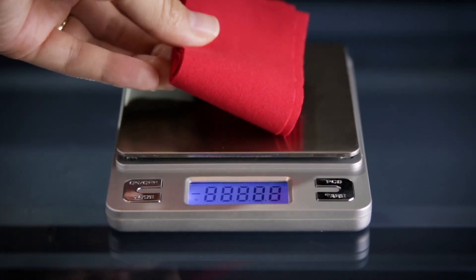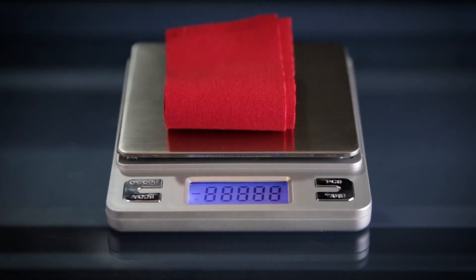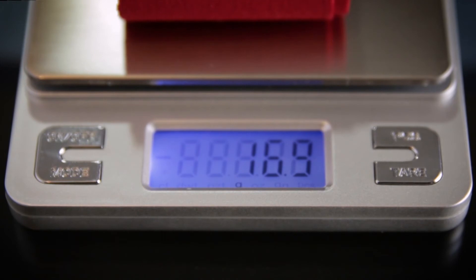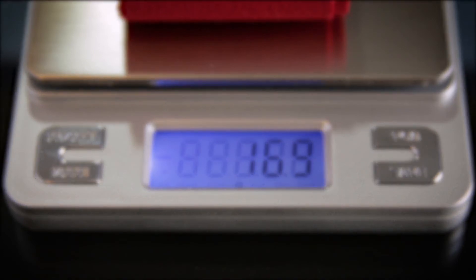Place all three fabric strips on the scale. Record the total weight, then calculate the average by dividing the total weight by 3. Please record this number as it will be used later in our testing process.